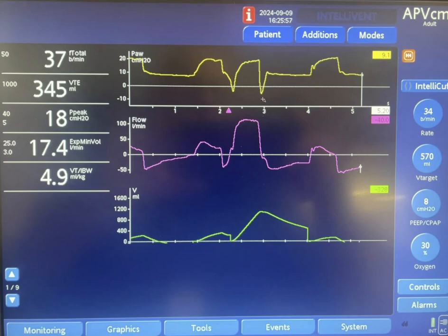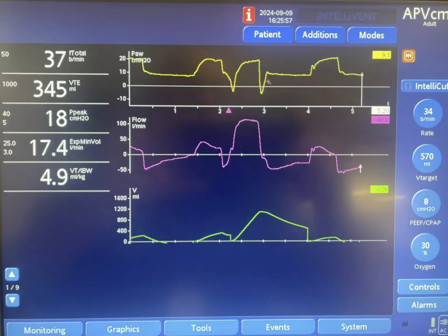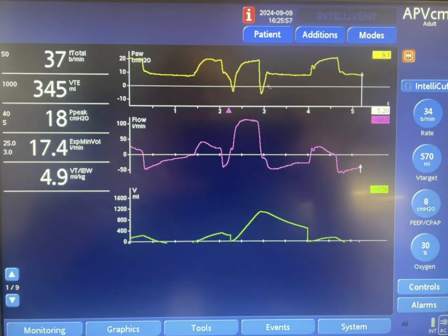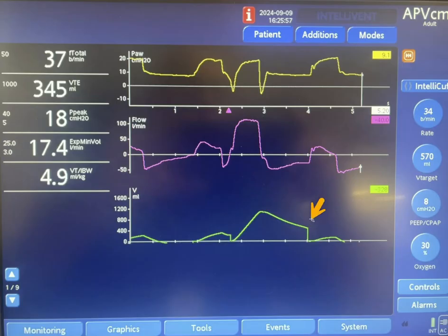Exhalation starts here. You can see the patient again took another breath — the pressure dropped below zero. However, it did not trigger another breath, even though the deflection is actually lower than before. You can see the inspiratory effort here: this is the start of expiration, but the patient initiated a breath that resulted in cessation of flow. It did not trigger the ventilator — the volume kind of plateaued a little bit — and then expiration continued. The patient continued to exhale, the volume goes down, and at this point another breath occurred, and this is time-triggered.